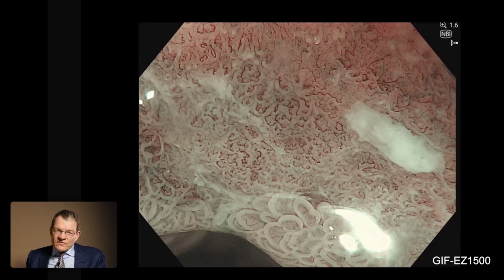Also, we have to admit in the Barrett's sometimes you have a lot of large glands, and the cancer is finally somehow hidden in smaller areas where you don't have these larger inflammatory glands. So Barrett's is still very, very complicated.